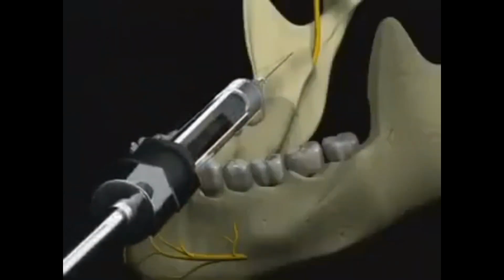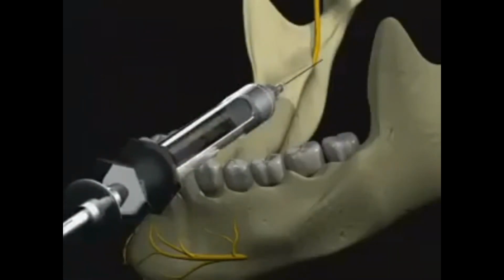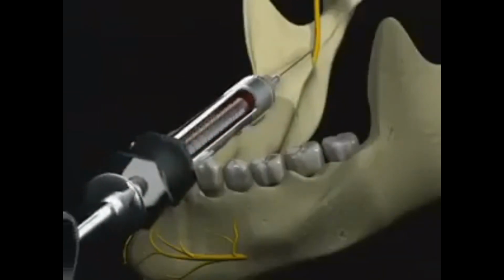If you contact bone too soon, in other words, significantly less than 25 millimeters, you will need to redirect the syringe and carry out the indirect technique. This is accomplished by withdrawing the syringe slightly, moving the barrel more medially over contralateral canine or incisors, and advancing again until bone is contacted.